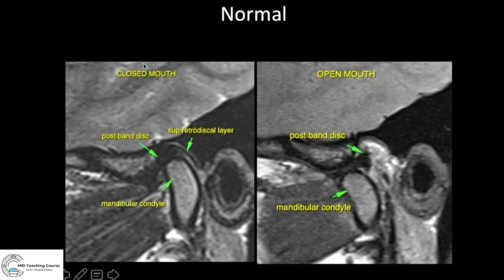This is normal closed mouth and this is normal open mouth. You can see the mandibular condyle, and here is the articular disc. On open mouth, the mandibular condyle has moved anteriorly and the articular disc still maintains its relation with the mandibular condyle — now the central portion is more in relation to the condyle. We evaluate these on sagittal images; coronal images can also be used in open and closed mouth, but sagittal is primary.